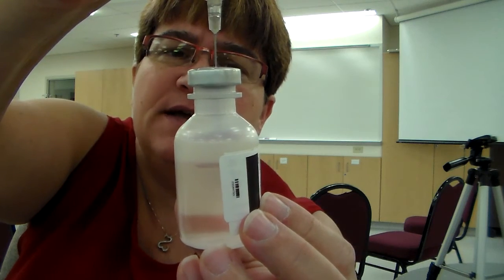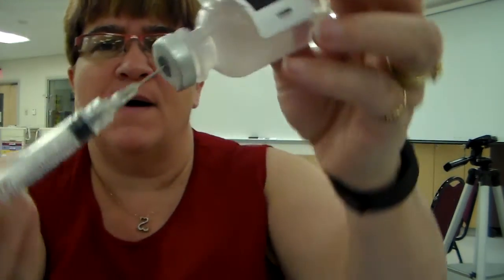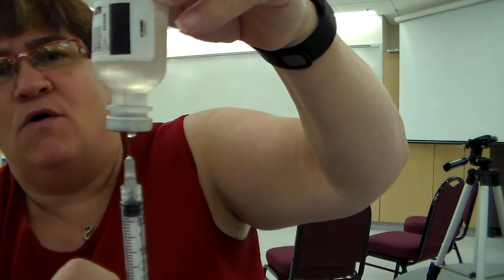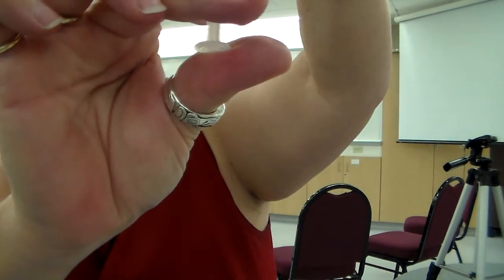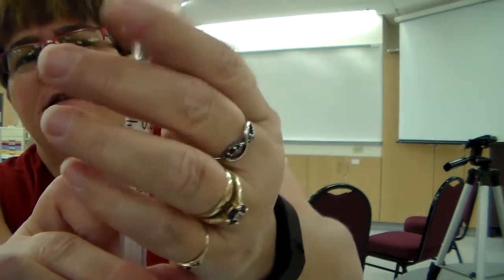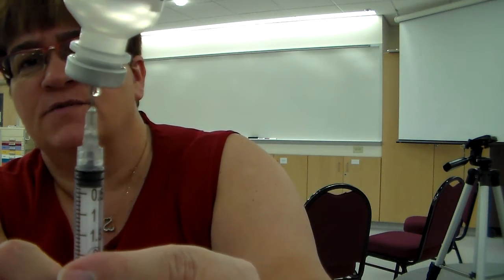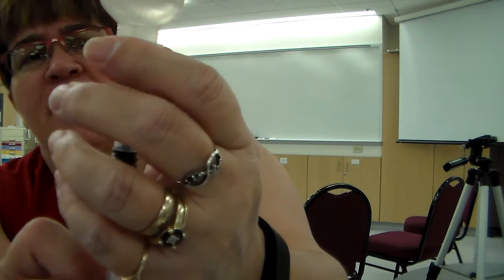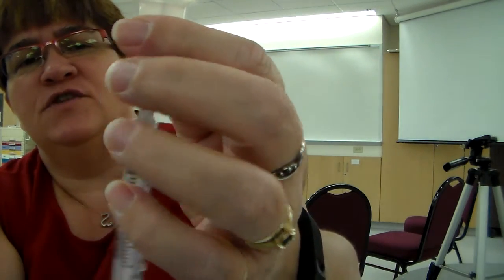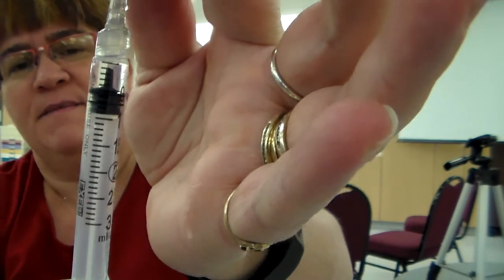Now what I want to do is I want to invert the bottle. So I'm going to turn the bottle upside down while holding on to my plunger right here, okay? See? Now, when it's a multi-dose, it may leak. It may leak from here, and that's okay. Okay, see that leakage? That's all right. Don't worry about that. Look how it's just automatically putting it in there because I've put some air.